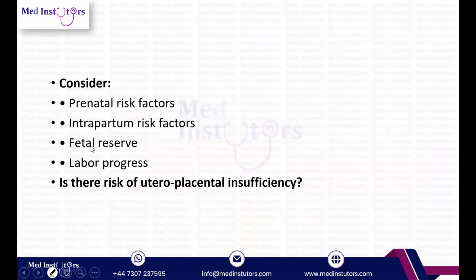Now, before this, for risk determination, we have to consider antenatal risk factors for the mother, intrapartum risk factors, fetal risk factors, the progress of labor, and if there are any other concerning factors like fetal growth restriction, uteroplacental insufficiencies, all of this has to be taken into consideration while we are trying to interpret the CTG. So as mentioned earlier, we have to look at the whole clinical picture.